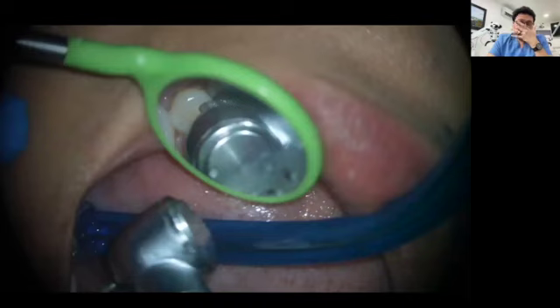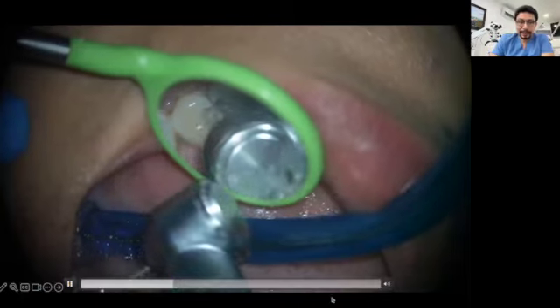Another important thing is that you need to select the position of the mirror. But for example, if you want to see the palatal wall of the tooth or the buccal wall of the tooth, we are not going to change the position of the mirror. You just need to change the angulation of the mirror, and you can angulate in different directions without moving the mirror from that position, and you will manage to obtain the vision that you need. You can angulate the mirror, and you can angulate your handpiece as well for having a proper vision of the area.